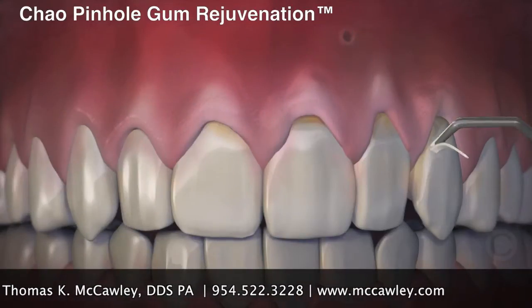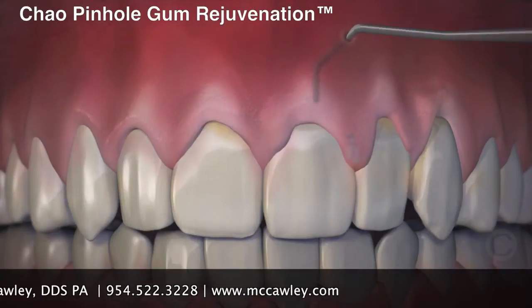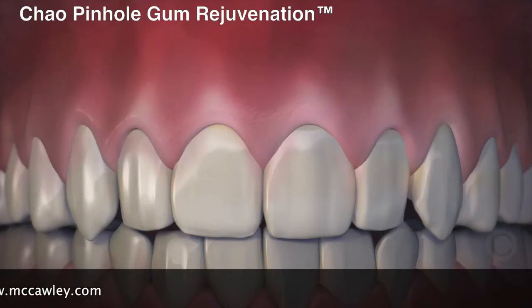When the recessed gums are corrected, tiny collagen strips are placed inside to stabilize the gums. Incredibly, the pinhole heals rather quickly and often overnight. When complete, the receding gums are corrected with a minimally invasive treatment that is quick, easy, and instantly pleasing.